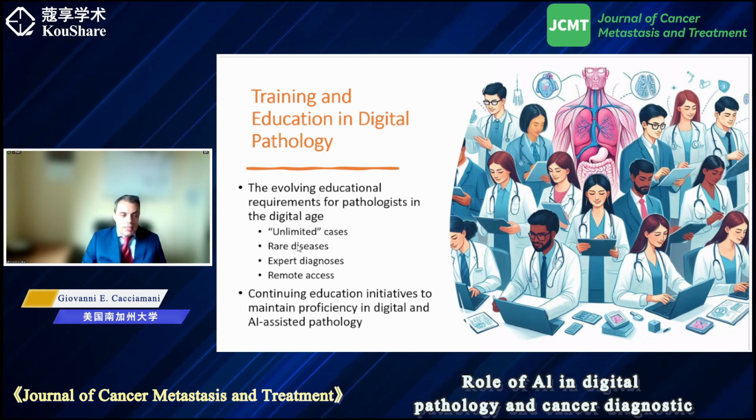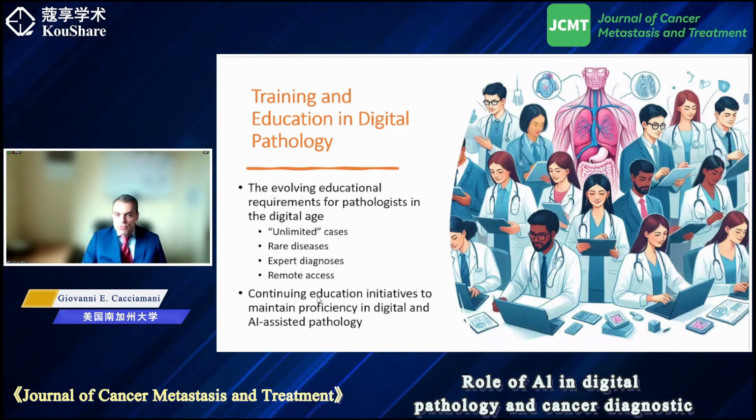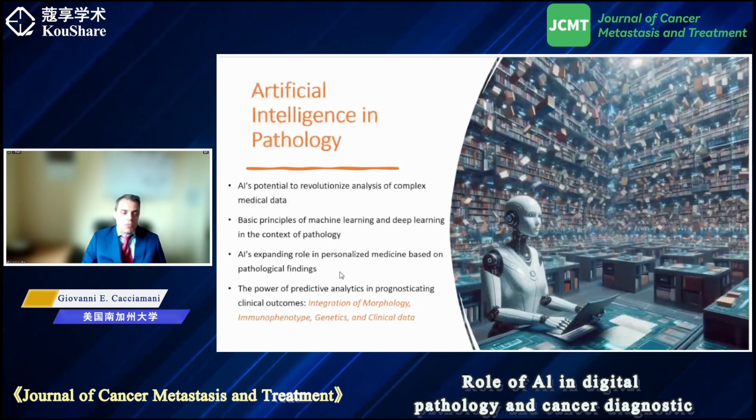We could study particular diseases with complete reports that were made by experts in the field. So expert diagnosis and 24 hours per day remote access. And this is useful also for doctors because, of course, digital pathology will make it easier to have continuous education and training with new methods and cases.